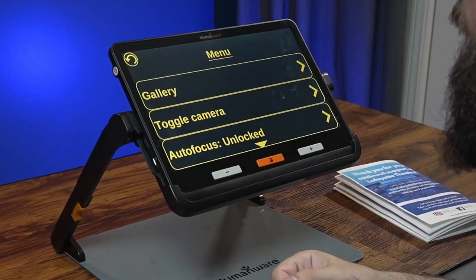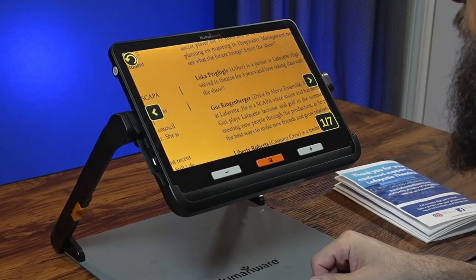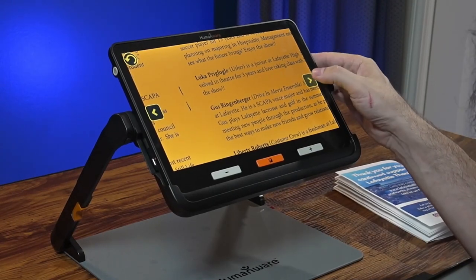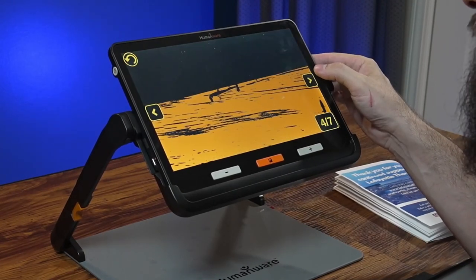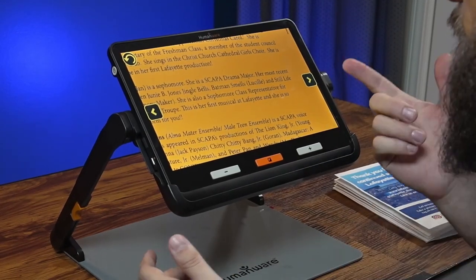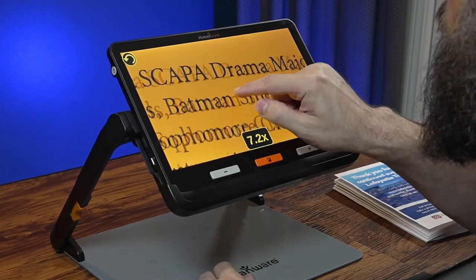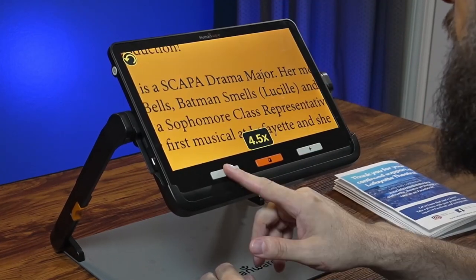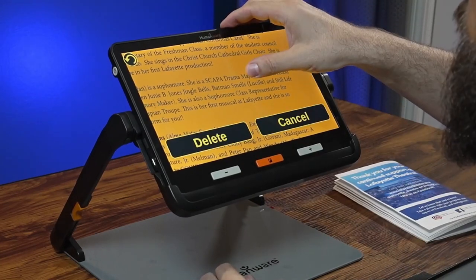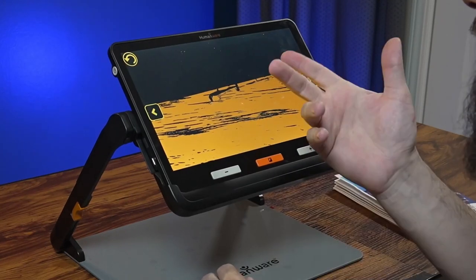You can access the gallery through the settings — it's the first option. Tapping it launches the gallery where you can use the arrows on the sides to browse through saved pictures. You can pinch to zoom, move around with your finger, pan and scroll. If you don't want an image anymore, zoom all the way out, then tap and hold the screen — a delete or cancel button pops up — tap delete and it's gone. The device can store over a hundred images.